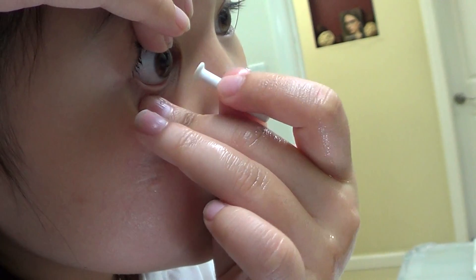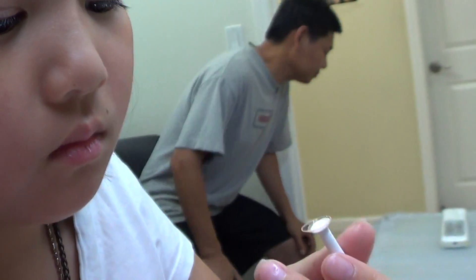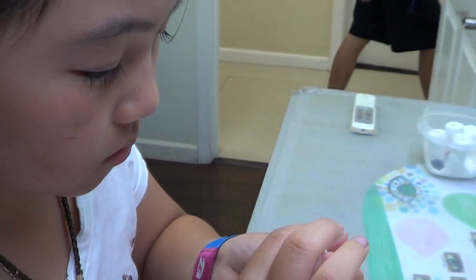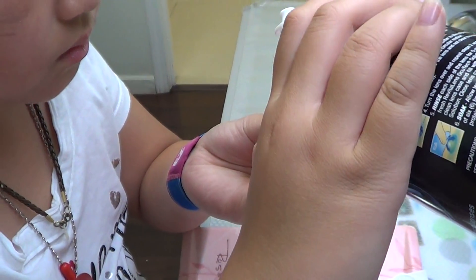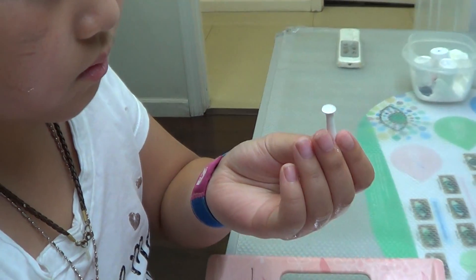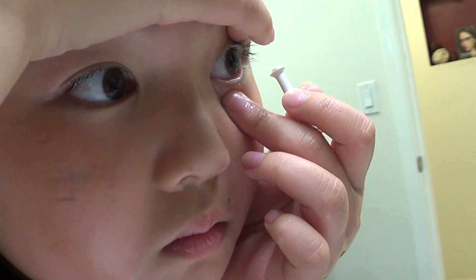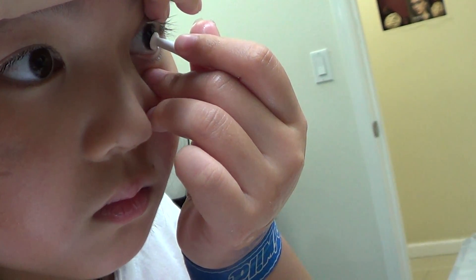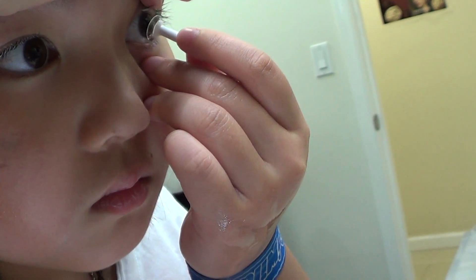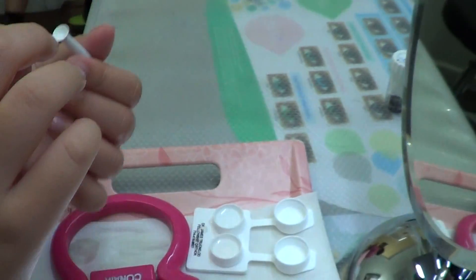Go ahead. Make sure off-center a little. Okay, make sure. Up center — perfect. The lens is already out. Now put the lens back in the case.